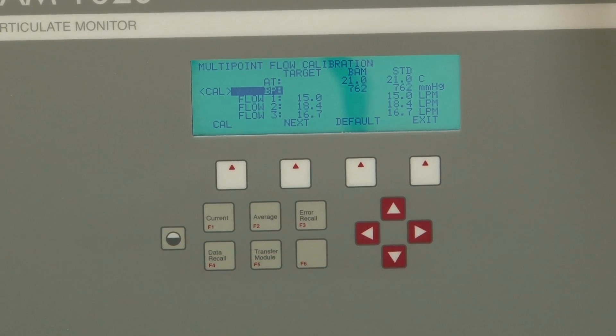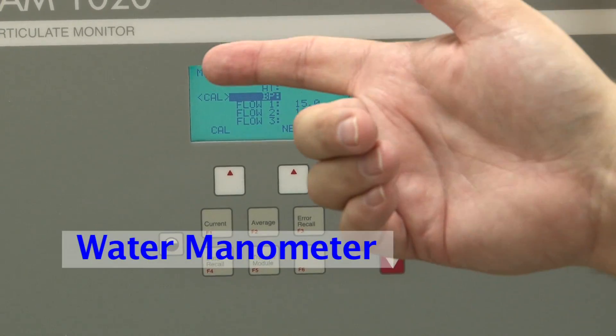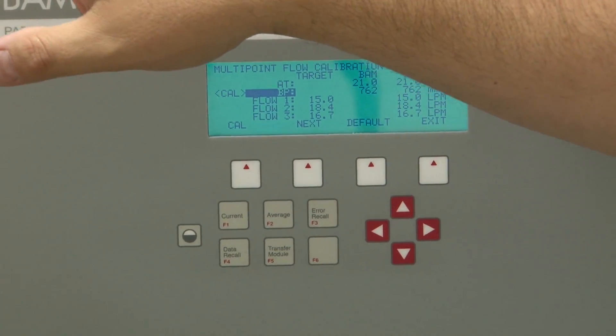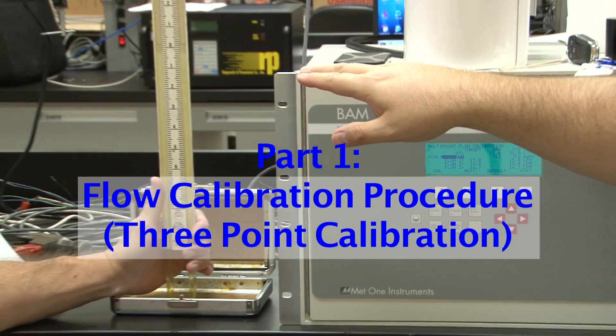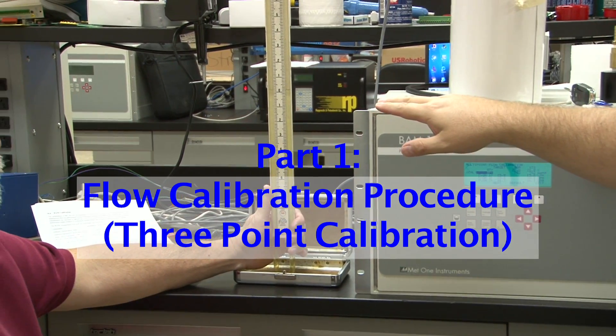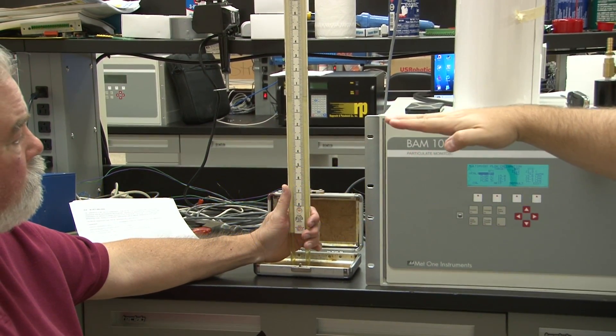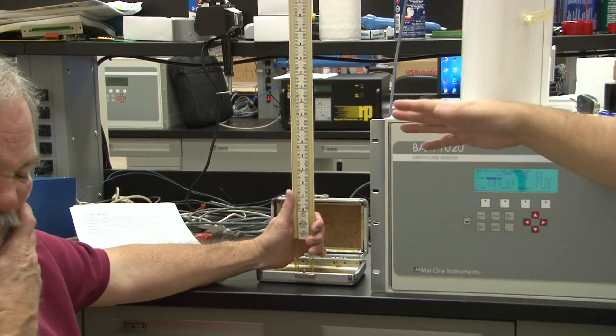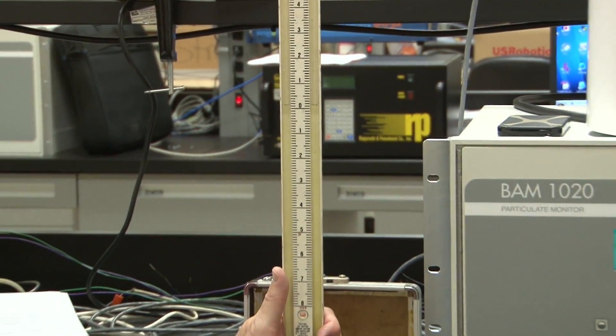For the flow, we're using a water manometer, which Mike's holding over here. We've gotten it filled with water — it's currently filled to an equilibrium at 0.1 inches. So our base number is going to be 0.1.